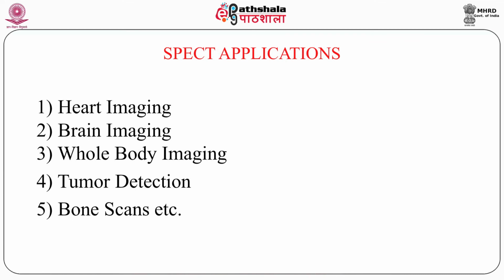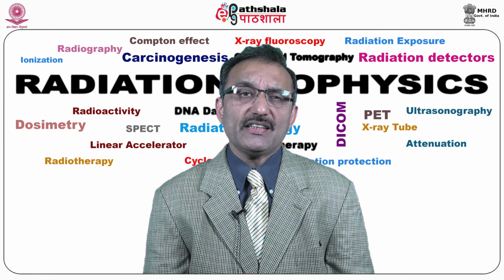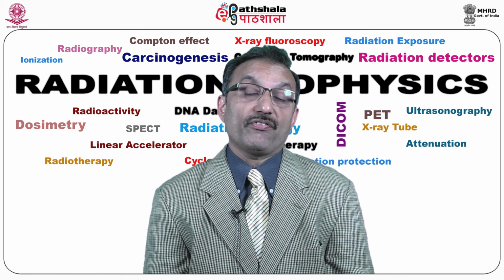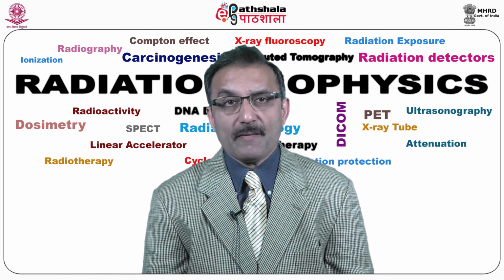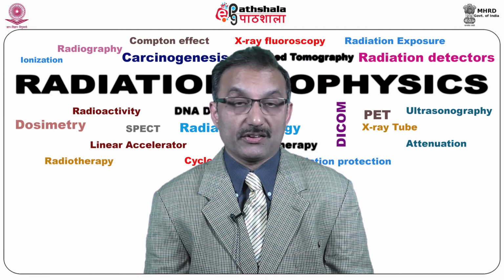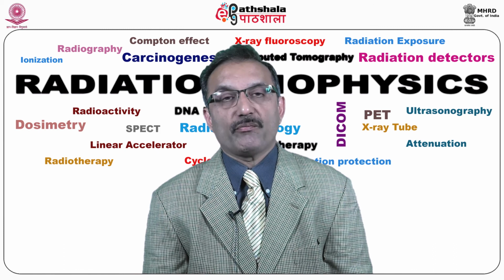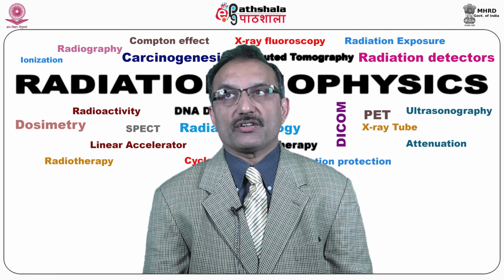Bone scans: sometimes you have a problem in the bones and you are feeling tired, you are taking medicines, but there are certain reasons, like bone deformities, or mets in the bones, because it has been seen that when a tumor is detected at one particular location, you find mets in certain other places, like the spine and other bones. So there SPECT plays a very, very important role to check, after treatment, before treatment, or during bone scans, whether any problem is there or not.